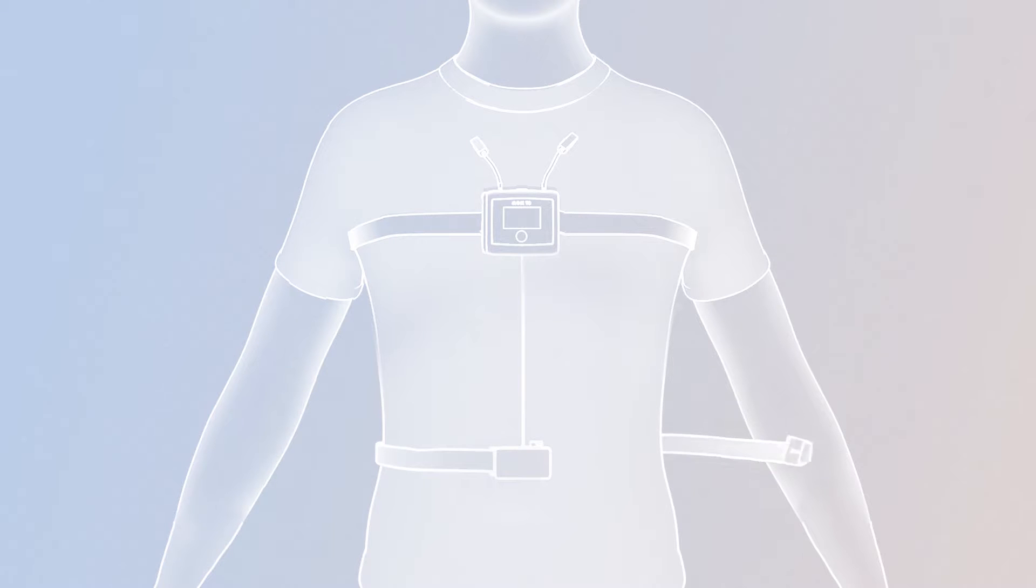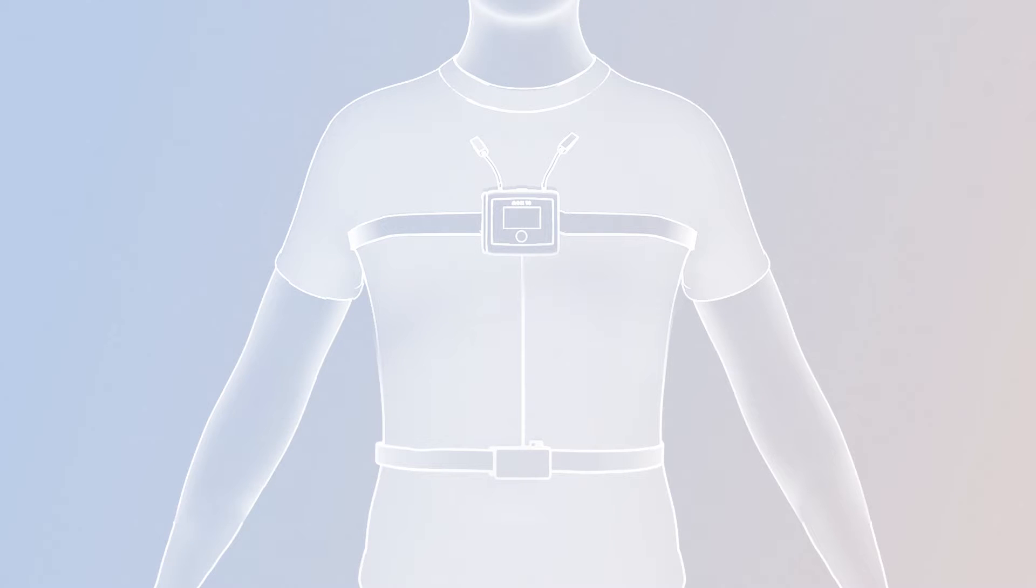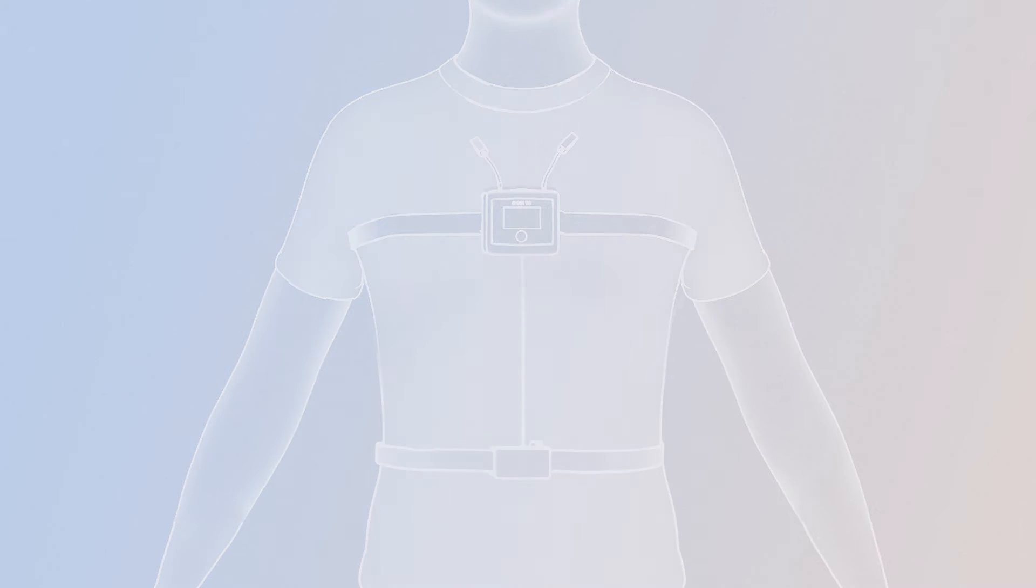Take the second belt and snap one end of the belt to one of the connectors on the abdomen belt connector. Arrange the belt around your back, make sure the belt is not twisted, and snap the other end to the lone connector over your abdomen. The abdomen belt should be just above your belly button. The length can be adjusted so it fits comfortably.